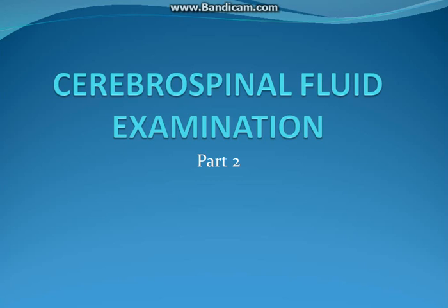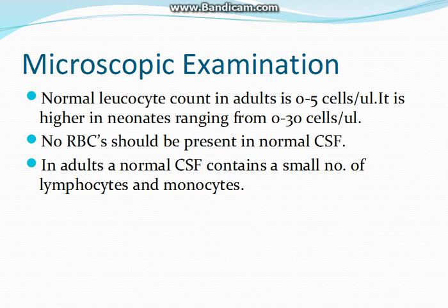Hello, this is part 2 of cerebrospinal fluid examination. In this video, we will understand the microscopic examination and the biochemical examination of CSF.